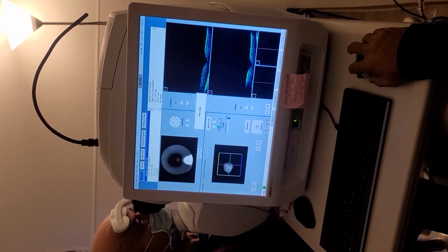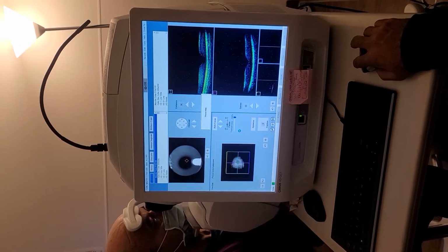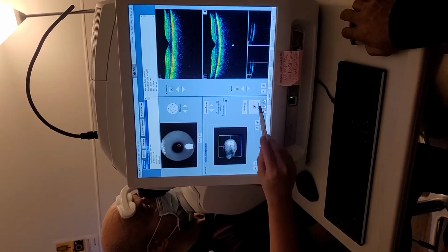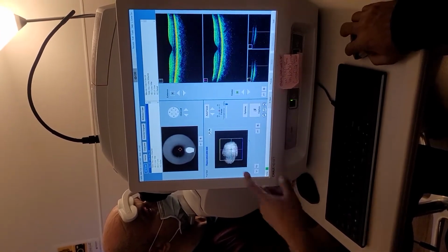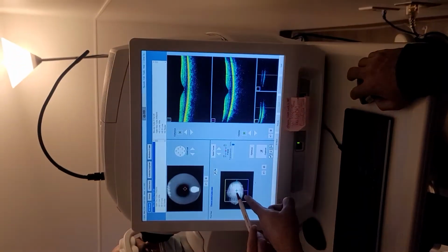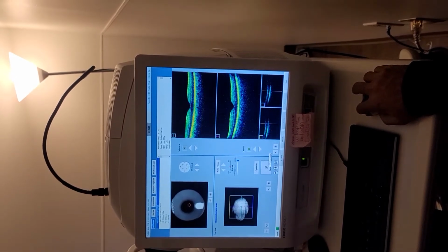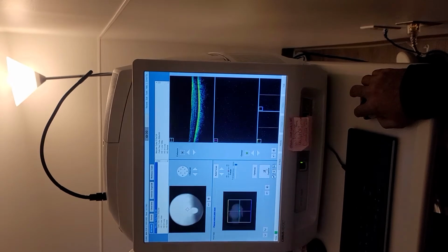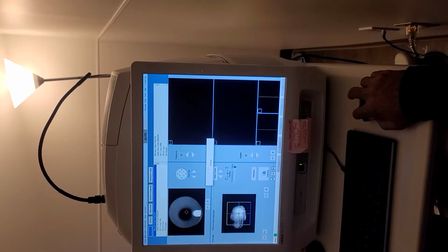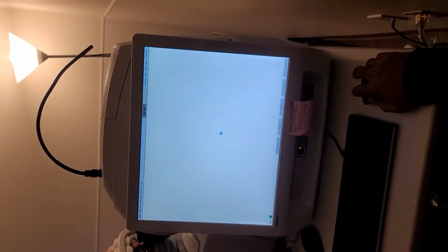This patient is not clear. That's okay, you gotta do these steps. Okay, now bring this up here. Okay, now go ahead and just capture it. Is that okay? That's his macula, so go ahead and capture it and see what happens. Don't blink, don't move. Hold, this one hold, okay? Capture. For the optic nerve, we need to blink.